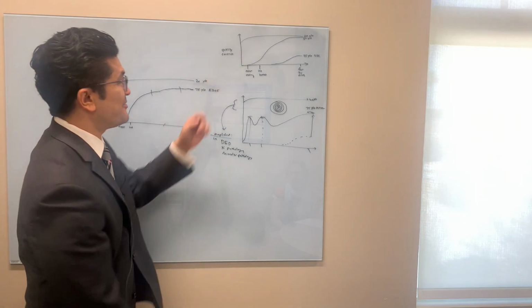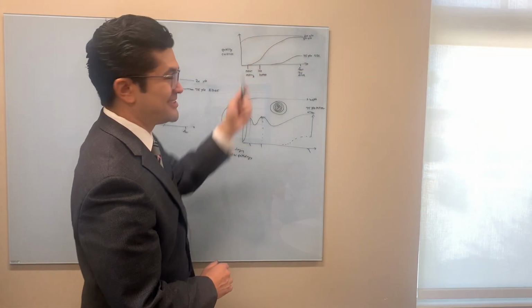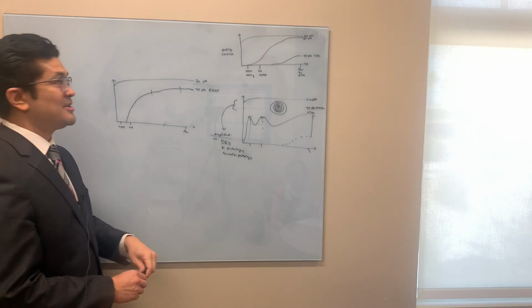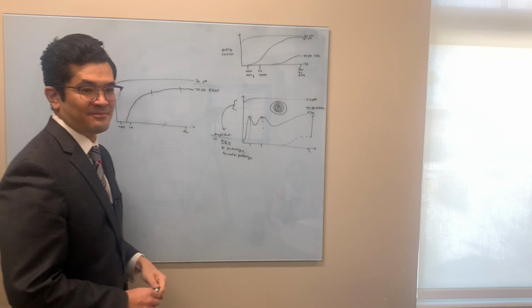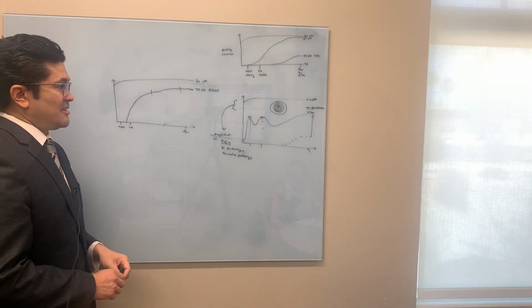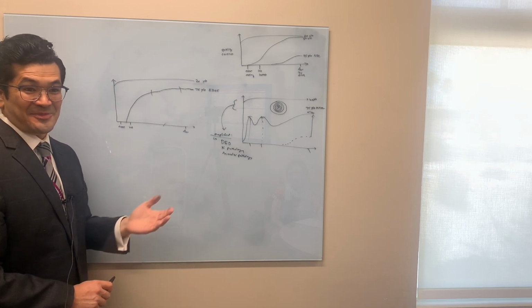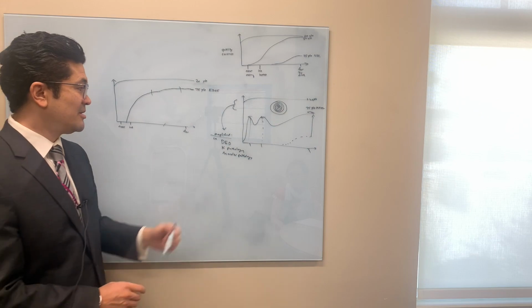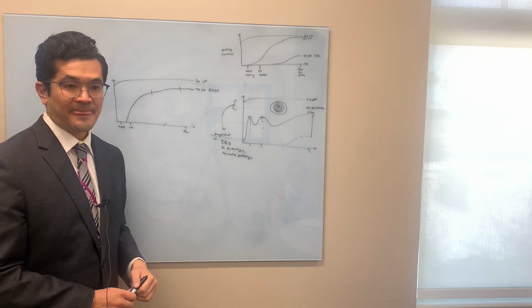I want a defocus curve that's better than a 20-year-old. That's what I want. If I'm going to put my eyes through the risk of surgery, I want to be sure that I'm better than that. I hope that makes sense. I mean, how do we decide? You really have to gauge the patient's personality. You want to look at their pathology here too.